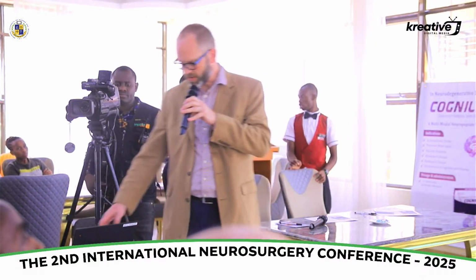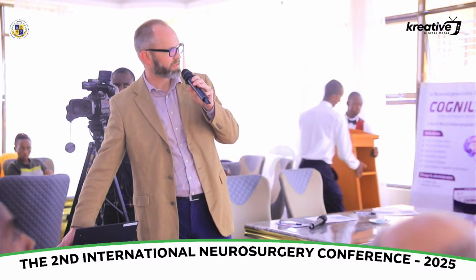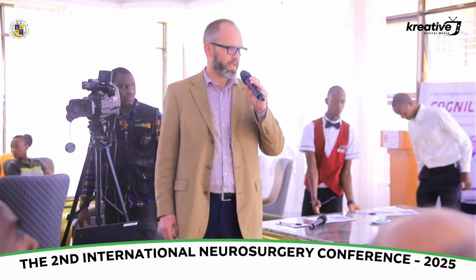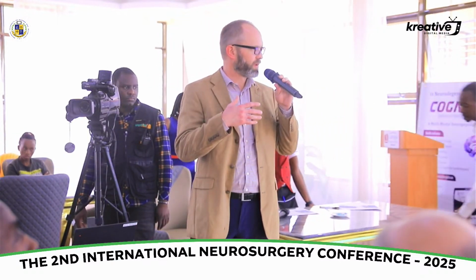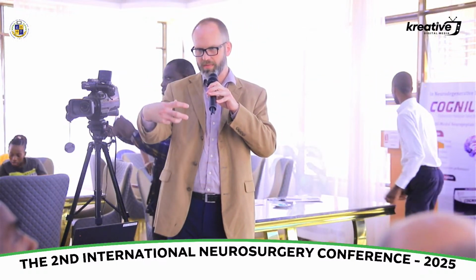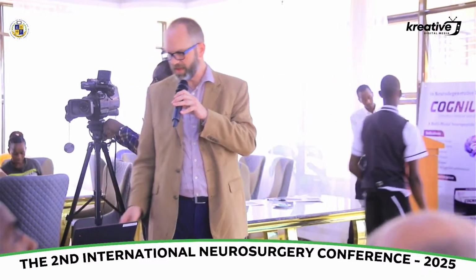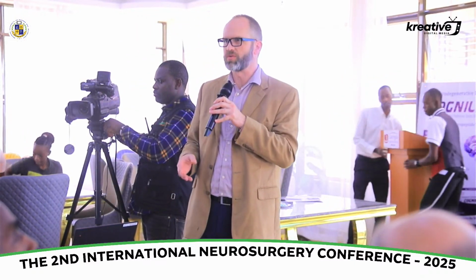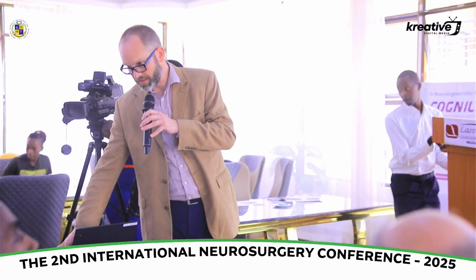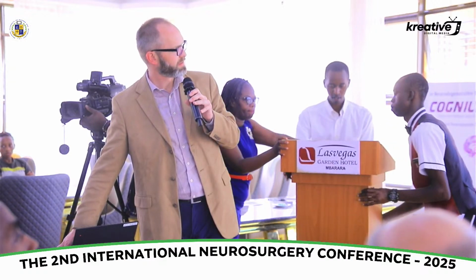It was mounted on a cylindrical chamber, and it resonated at 15 megacycles per second, and then went through water that was in the chamber to essentially a rubber condom that was on the end, and then they tried to see if they could send these through tissues and whether they could tell if there was tumor inside brains or not. And this is a diagram of that.